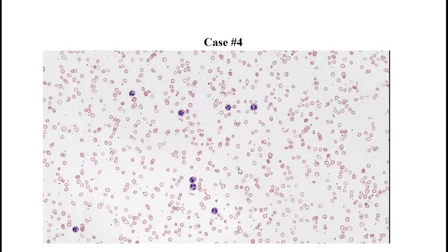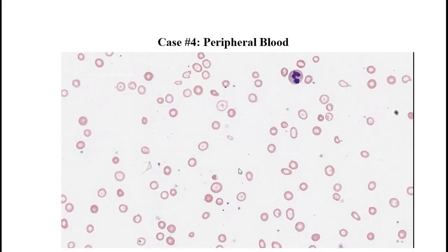So look at the peripheral blood. Definitely, there's some problem here. The white cells, there are enough neutrophils there, but there are lots of hypochromic microcytic cells, and there are not too many cells there either, which confirms that the patient is extremely anemic. Higher power. There are some hypochromic macrocytic cells. Lots of these are microcytic with target cells, and occasional schistocytes as well.